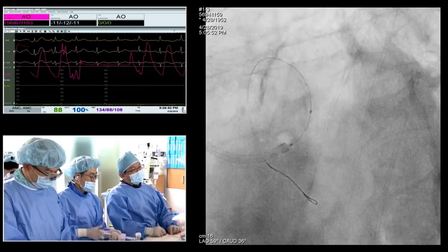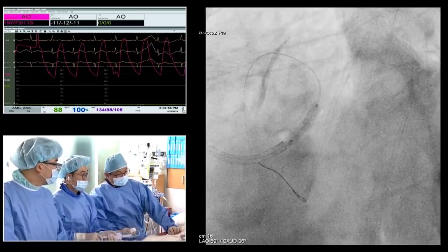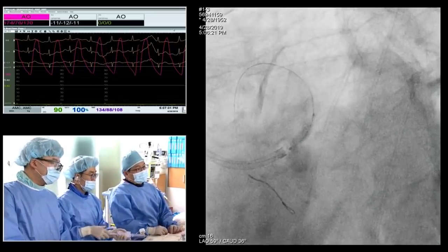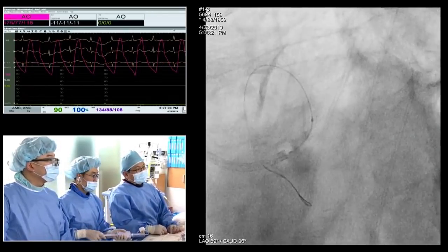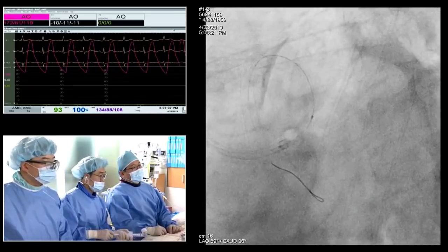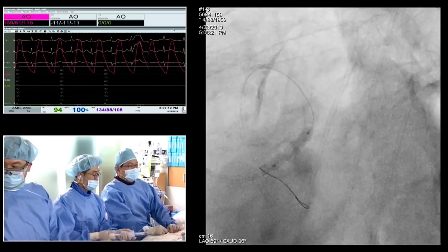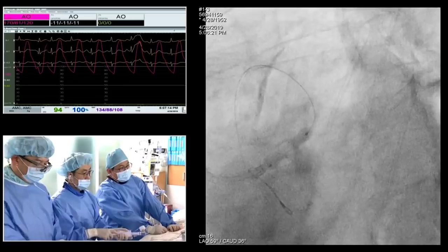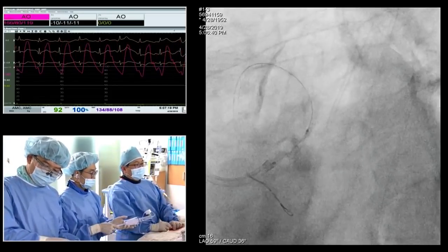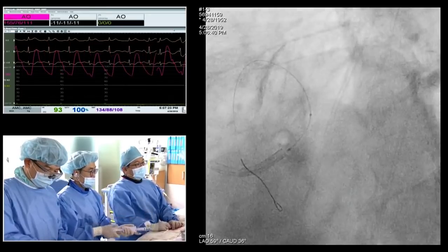10. Usually, before we remove the stent wire from some place, we have to take angio to make sure no complication. Thank you. So is this the 12, non-compliant balloon? 14. Yes, non-compliant balloon. 14, 16. So whenever you do the balloon crush, use the non-compliant balloon in Asan Medical Center? Yes. 10.